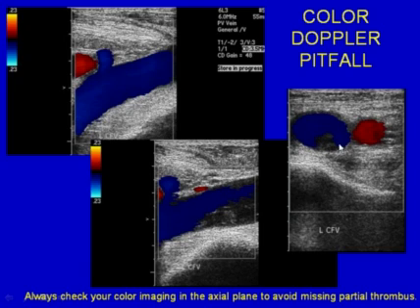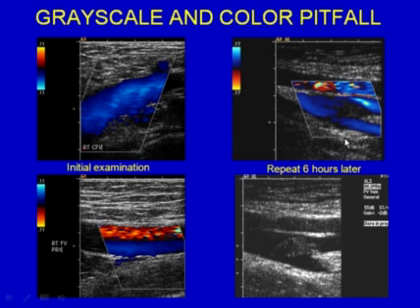In terms of its dimensions, it's sitting only in the middle and posteriorly on the vessel, and if you image through this part in long axis or this part in long axis, you'll miss this entirely. Here is a patient where we had an initial exam.